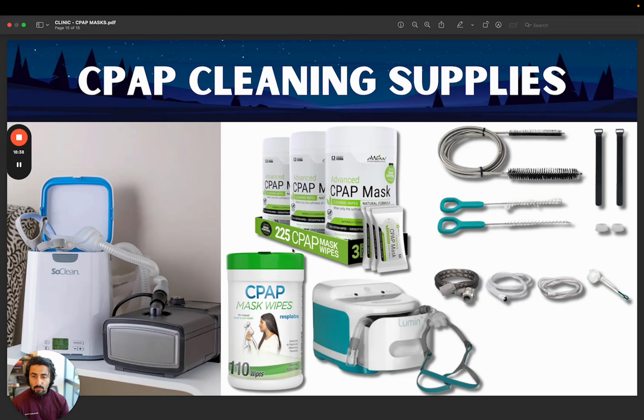To keep the hose and mask clean, you may have seen these bottle sterilizing units that we use for children. I have 3 young kids. Most of our patients know this, and we used to use them for cleaning bottles, but the same idea is also being applied to the CPAP mask and the hoses. So one can either buy one of those, there's a couple of different ones available. You see what fits your budget. But I always recommend patients first get used to CPAP, make sure it's something that's working well for you, and then invest in one of these machines if it makes your life easier.